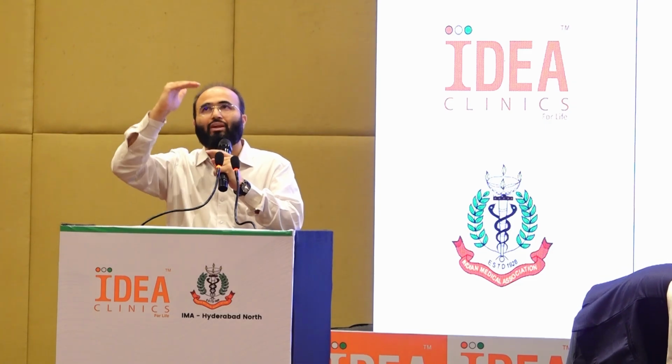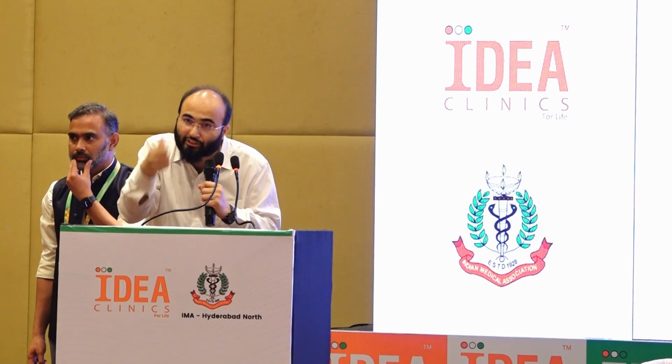You also mention what is the maximum basal that can be given. If the sugars are going haywire, if they are increasing, what is the maximum that you can go? So this pump can go from 0.8 to say 1.6. It is going at its maximum now. And despite that, post-meal, the patient's sugar is going beyond 240. Now it gives an auto correction.